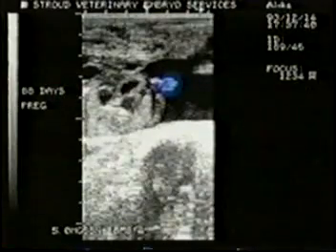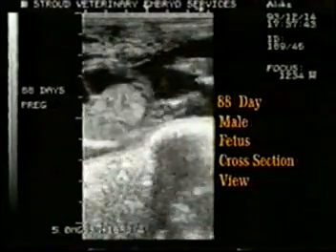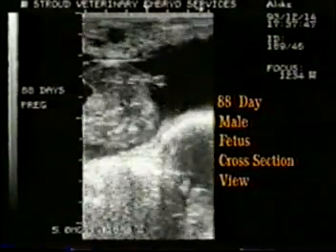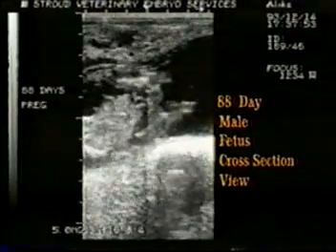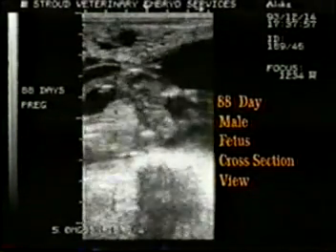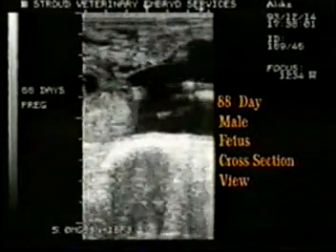The blue highlighted area shows the male GT. By 85 days, it often appears trilobed. By orienting the umbilical attachment to the abdomen, the presence or absence of a male GT can be determined.